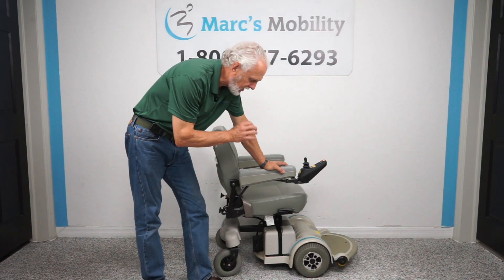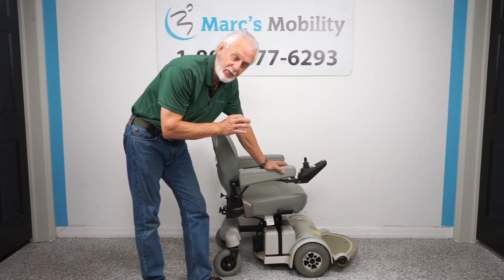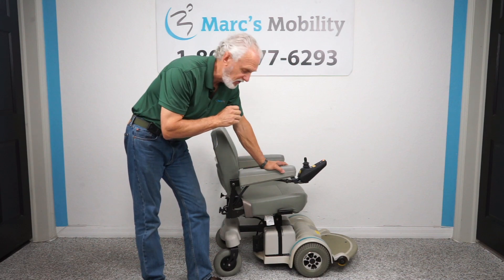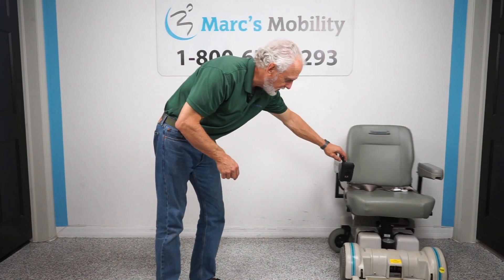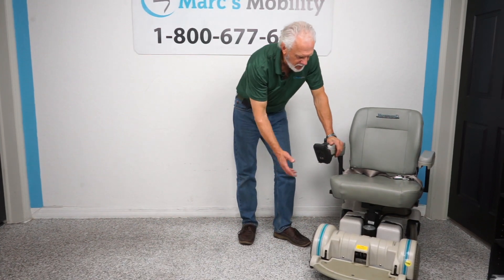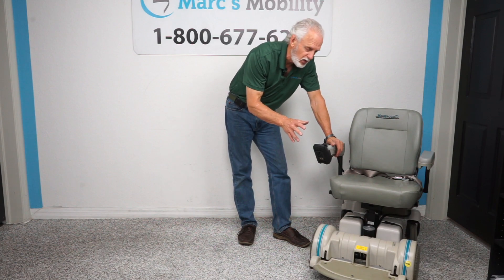All right folks, we have here a Hover Around MPV5 power chair. This chair has one thing that most MPV5 Hover Arounds don't have — it has the five-inch seat lift. This chair only has 13 hours of run time, so it's literally brand new.